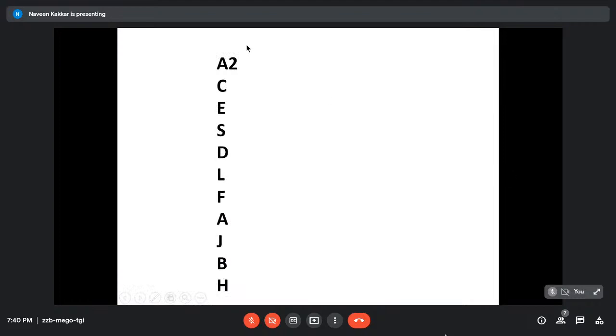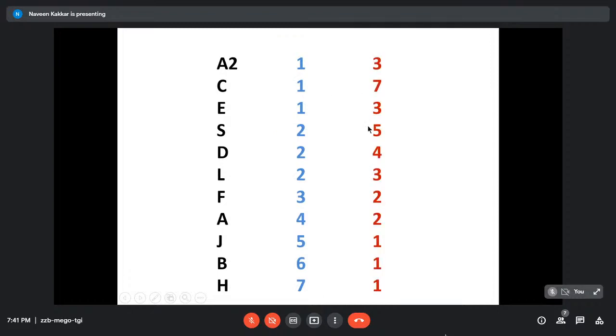I just put this, the sequence of different hemoglobins, not all of them run, some of them running together in one band, just to show you the difference in electrophoresis and HPLC patterns. So that's where the positions are. So first position you'll find these two, then S, D, G, L and so on. While if you look at the HPLC for the same hemoglobins, it's a different pattern altogether. So you can't match one to one. One is totally opposite, two is crossing over, three is again crossing over, four is crossing over, and so on. So all I'm trying to say is do not remember the electrophoretic order to interpret HPLC.